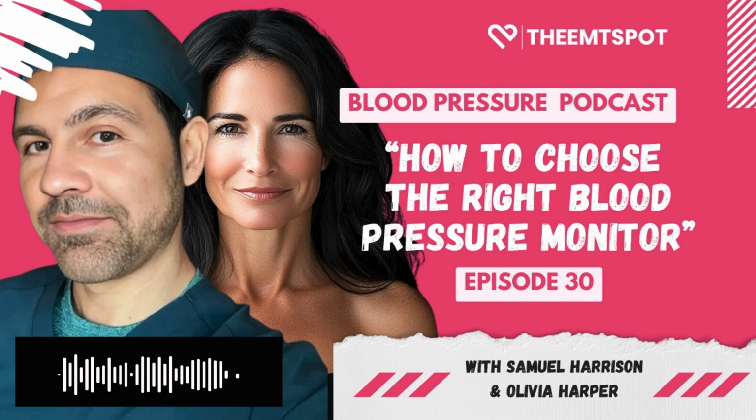I mean, isn't going to the doctor enough? That's what a lot of people think, but home blood pressure monitoring is getting more popular these days. It seems like it, and for good reason. It's not just about convenience. It's really about giving you the full picture. A single reading at the doctor's office is just a snapshot. Exactly. It's a single frame of a much longer movie. You're not getting the whole story, are you?